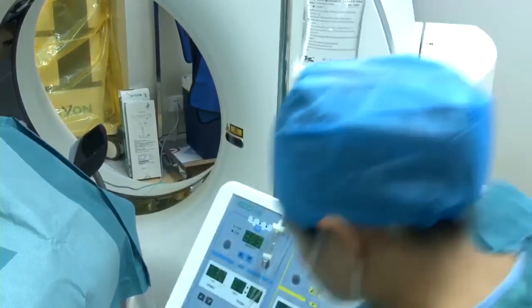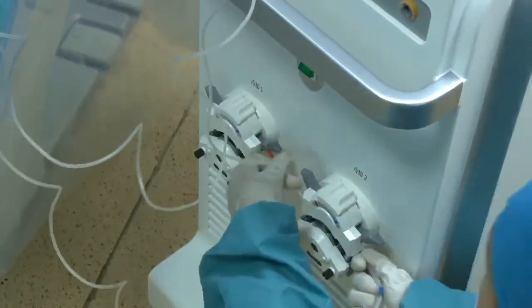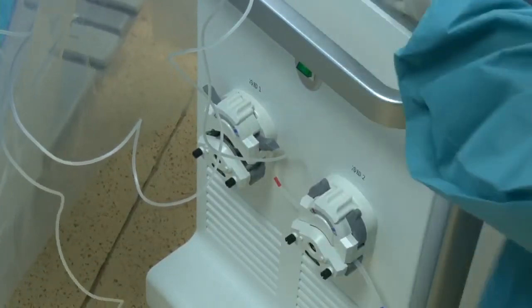We are seeing the room right now. We are seeing the operation room, the CT scan. Not the images. Ablation. Oh, okay.